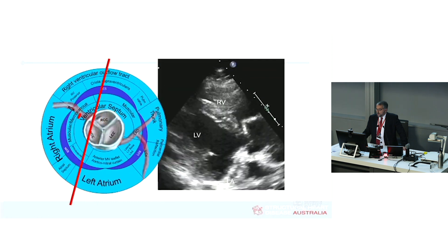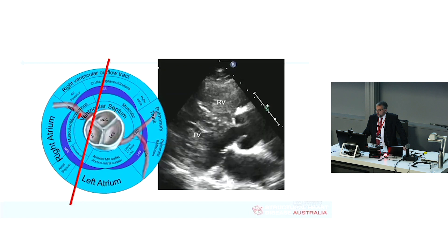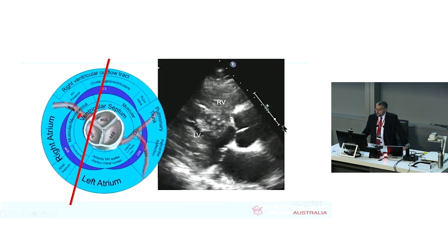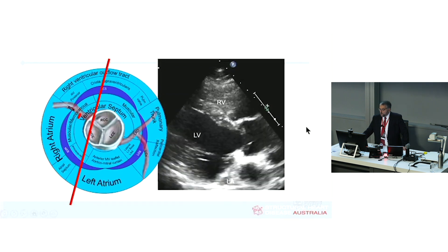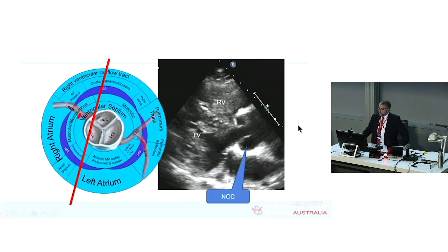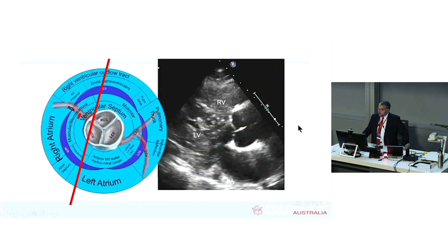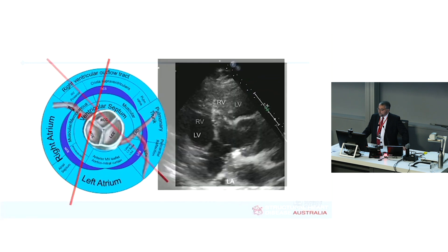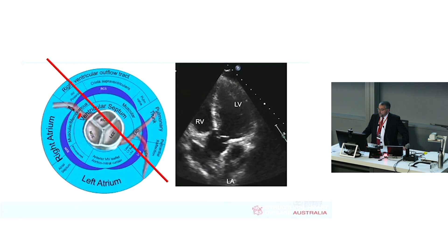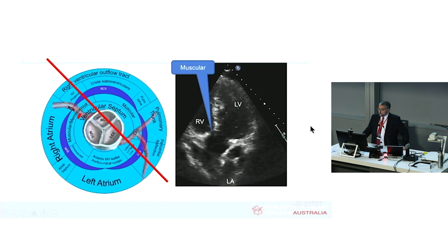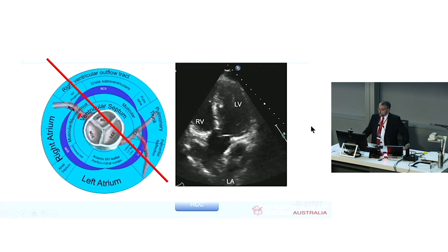Tilting towards more medial, you're bringing in a little bit of tricuspid. When you see tricuspid, you know you're more towards the medial, and you can see the membranous septum. You can understand how a VSD might impact upon that cusp. The five-chamber view is actually a cut through the right coronary and left coronary cusp — LCC and RCC — with the muscular septum visible.